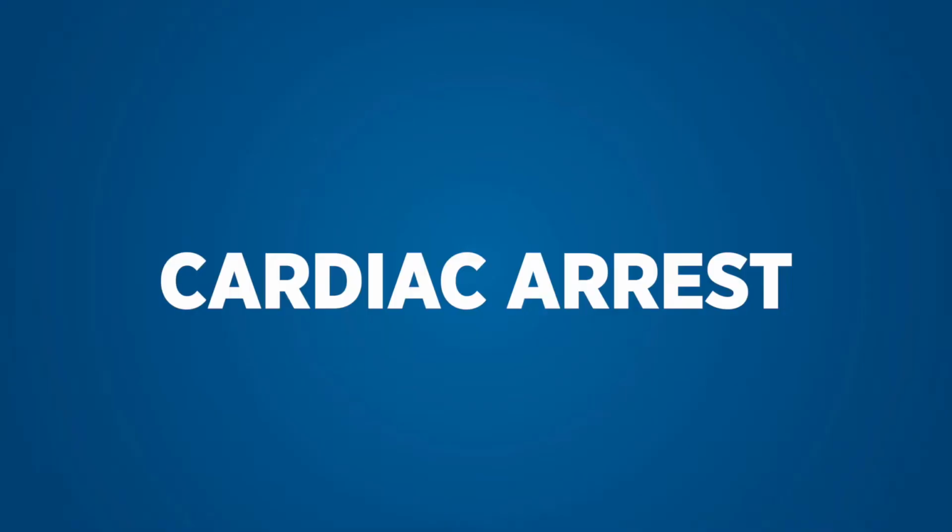Hello, I'm Dr. Skinner. I'm one of the cardiologists here at Saline Memorial Hospital. February is American Heart Month, so I wanted to take this opportunity to talk about cardiac arrest and what that means, and also to show you how to use an AED. An AED stands for Automated External Defibrillation, and hopefully you'll see those around in the community.